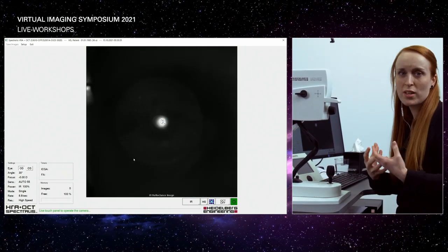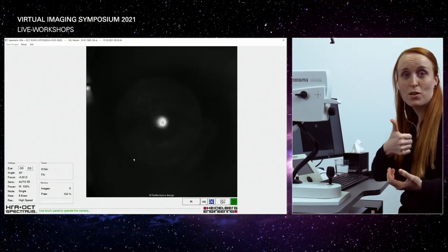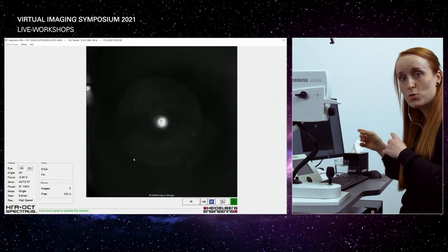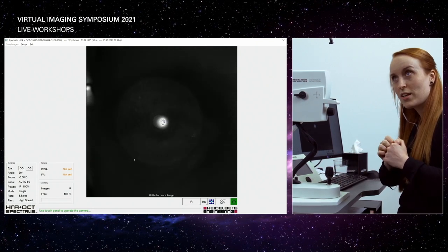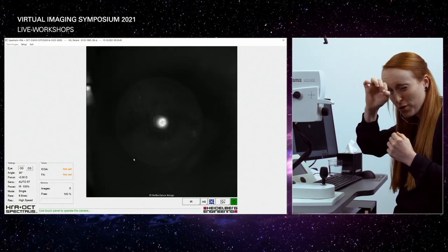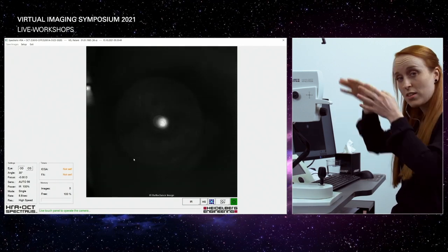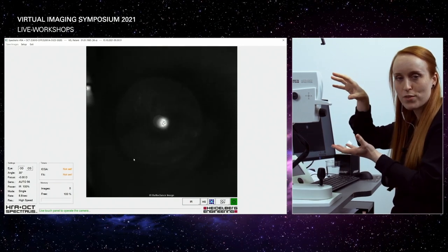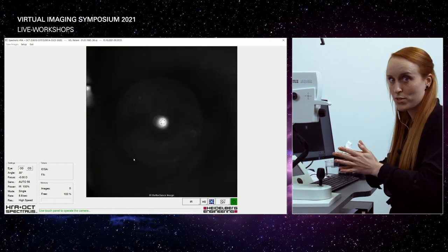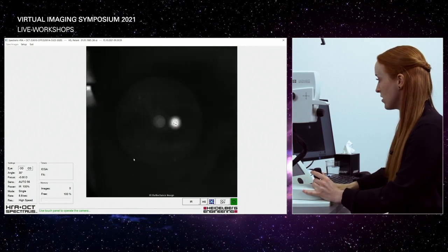So what we are doing is we measure with the help of light. So the first thing is we need to get all of the light right into our patient's eye. And this is what we are doing right now. We can imagine our patient's pupil as kind of a keyhole we want to look right through, okay? And what we have to do for that is keeping the camera right in front of this keyhole, not too far right, not too far left or something like that. And this is what we are doing by centering this little reflex.